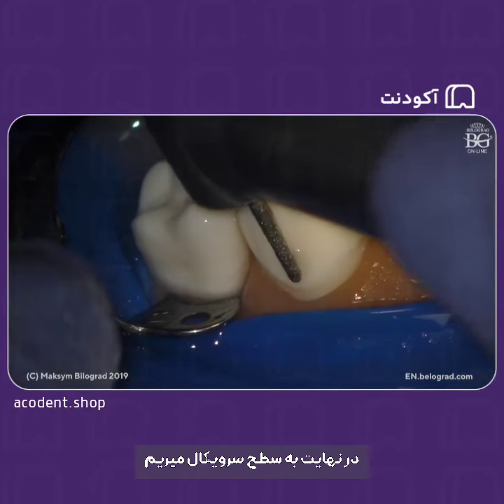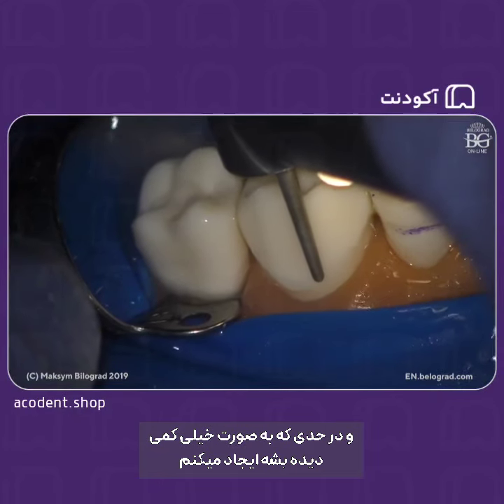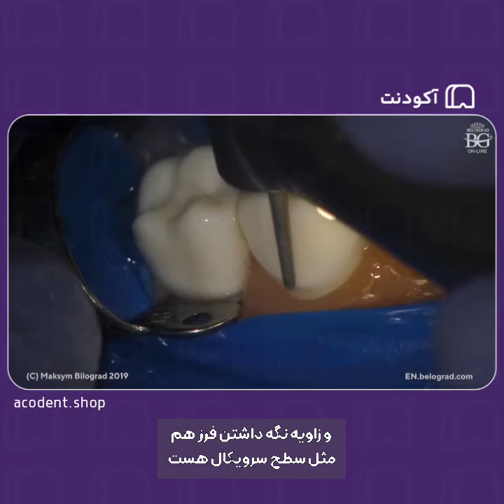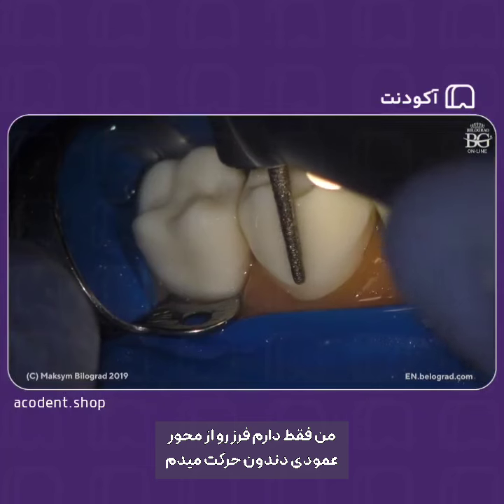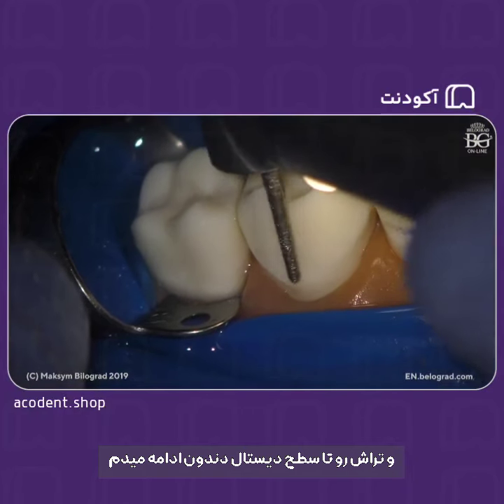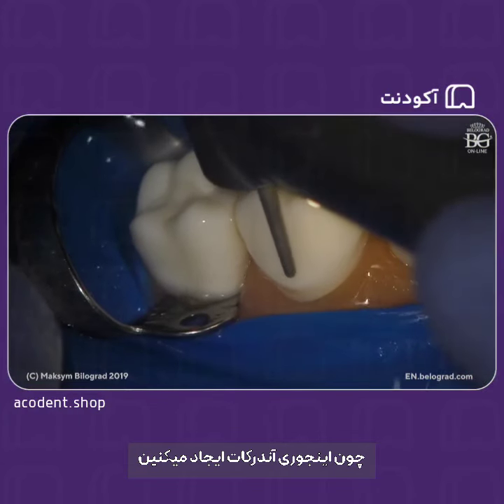And now finally we will move to the cervical plane. I will make the initial finish line really slightly visible, just a scratch, and the angle that I'm holding my burr is the same as the cervical plane. And now take a look at what I'm doing. I'm just moving my burr from the vertical axis of the tooth, and making preparation to distal. Okay, like this. Don't make this angle, otherwise you'll get an undercut.